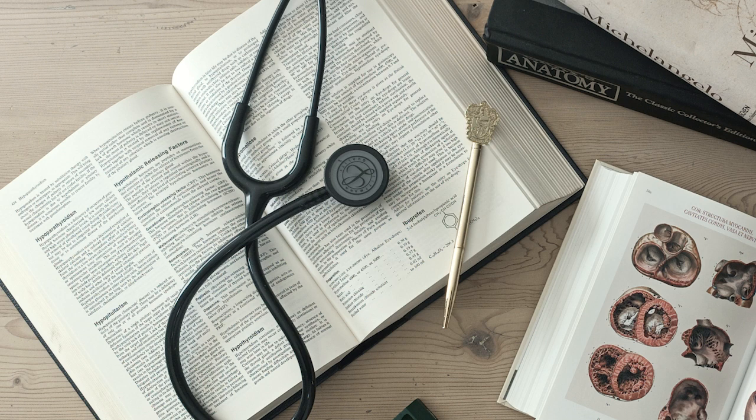Okay, so we've got this amazing, complex electrical system, and the ECG, the electrocardiogram, is our window into it, right? Our way of reading its electrical story. To really understand and diagnose arrhythmias, we need to be masters of what each wave on that ECG corresponds to physiologically. That's a fundamental truth. Your ECG interpretation skills will directly translate into patient care. Let's break it down. The P wave represents atrial depolarization.